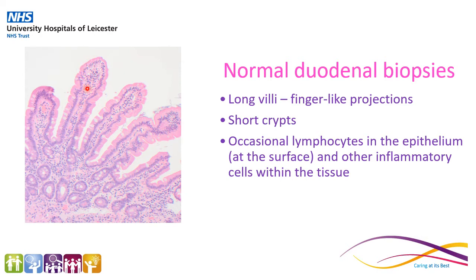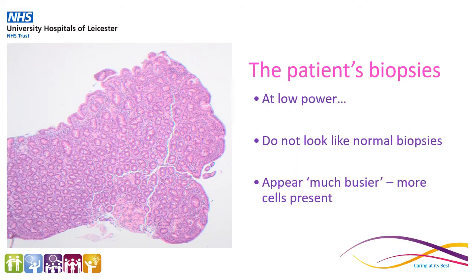And within the lamina propria, the underlying tissue, there are more lymphocytes and occasional inflammatory cells. Now these are a normal feature, but there shouldn't be too many of them.